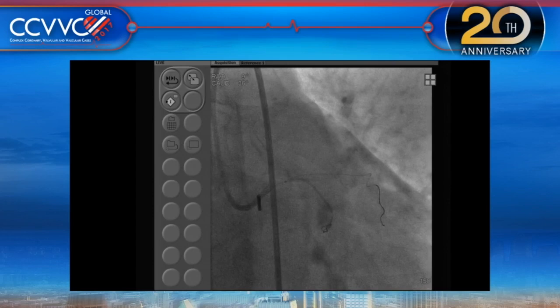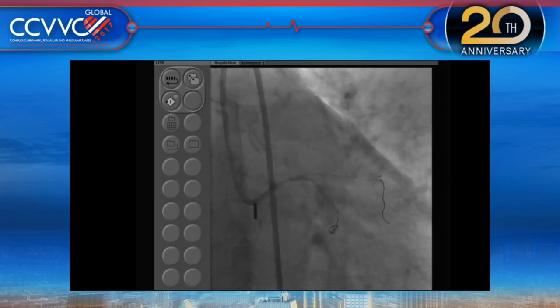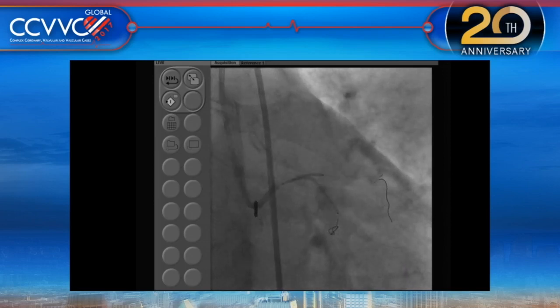Dr. Matthews, you are asking something. Yeah, question: what do you do to reduce the restenosis of the circumflex ostium? If the circumflex ostium stays the same even after you have done the rotational atherectomy, use the cutting balloon, then use a high pressure. So clearly, the preparation of the ostial circ is the most important in these cases. And also when we are doing a mini crush technique, we have gone to the distal strut, so it has been opened nicely. So all those factors. Is there any difference between circ to left main or LAD to left main? Yeah, I think it depends on which vessel is larger.